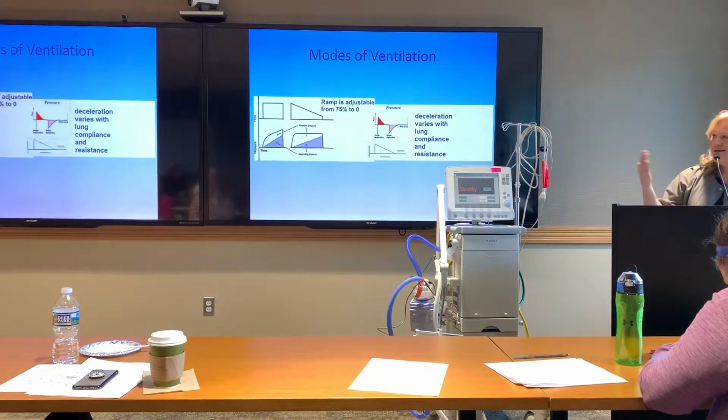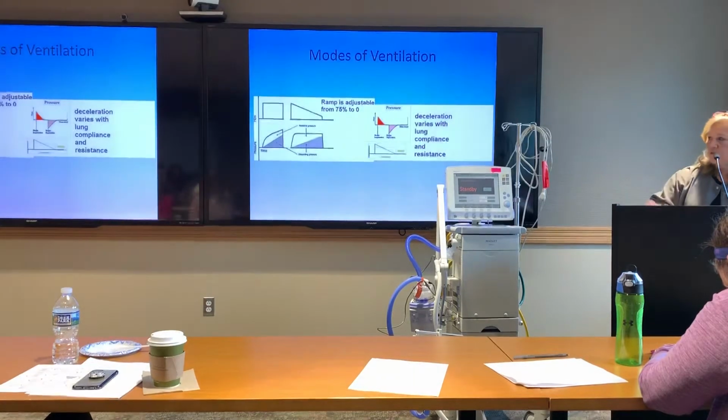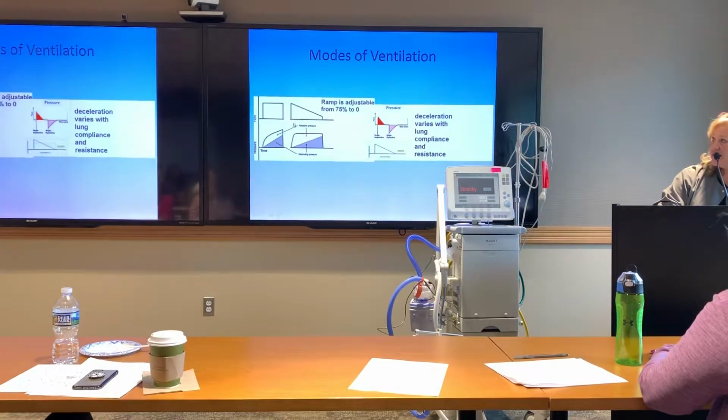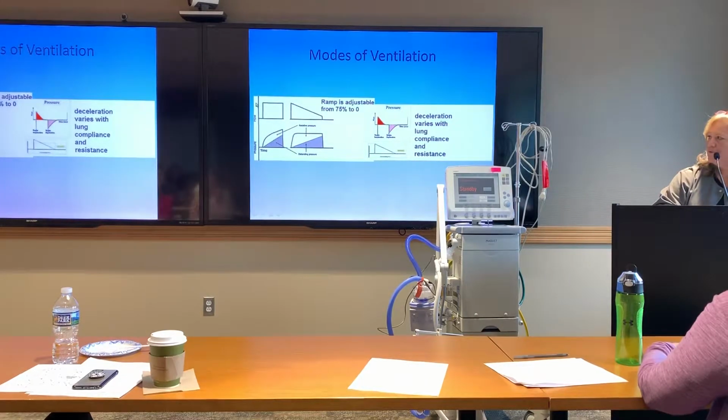And again, better distribution of the tidal volume. So if I get the flow fast here, then most of the tidal volume is being delivered early in the breath, so you have better time for gas exchange. So if I'm doing volume ventilation, I would like to choose that option, and we pretty much do. I just in-serviced all the MICU docs, and we went over all of this, and they all know this is the better one to do. Unfortunately, our vent always defaults to the square one, but anyway, we can change it. It's easy enough to do.